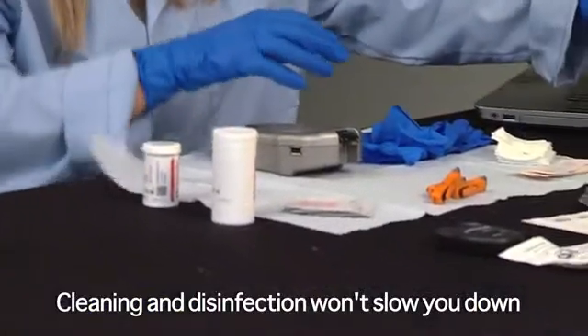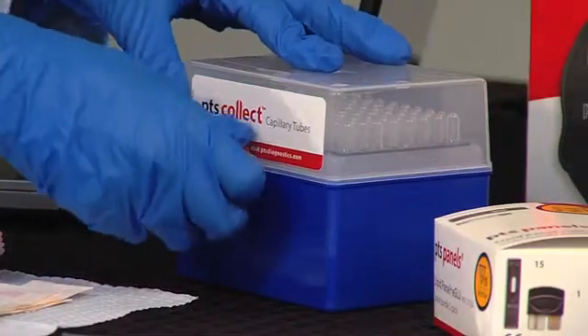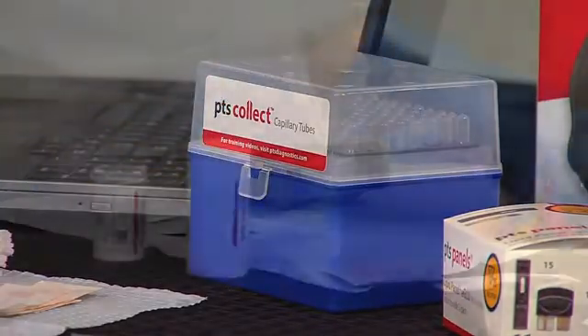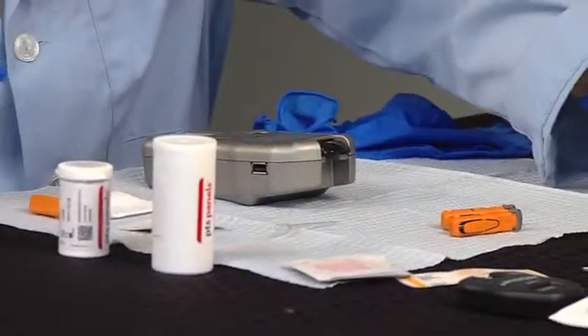It's important to let the analyzer completely air dry before you use it. This cleaning and disinfection process won't slow you down at all — you can do this while you are getting ready for the next participant. This is a good time to prepare your patient logs or anything else you need to do to perform your next test.